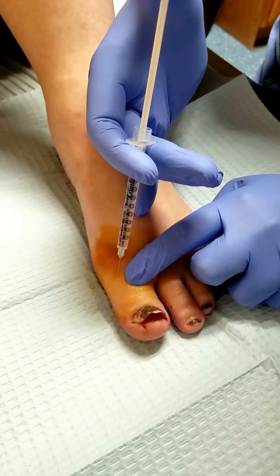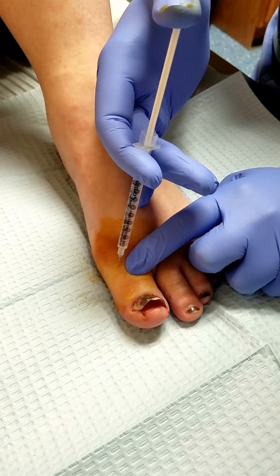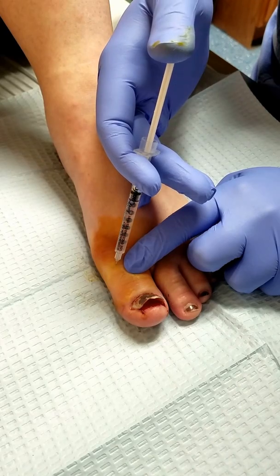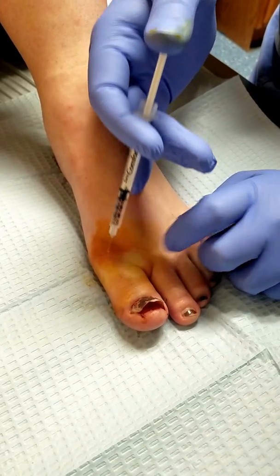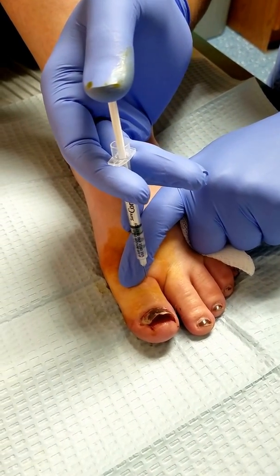You'll feel just a little poke right here. This is going to get the superficial skin so that way when we give you more of the other medicine, your whole toe should go numb on the other side. A little poke and the last one right here.